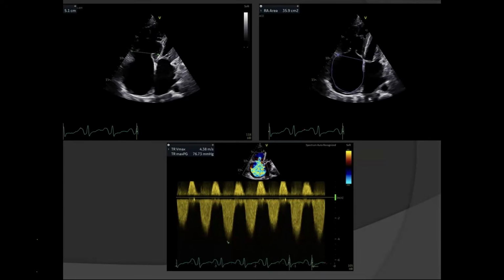If the patient has atrial fibrillation, we should have an average of 5 values. But in this patient, you can see the ECG tracing. The patient is in sinus rhythm, and this is primarily respiratory variation. So we've calculated the maximum pressure that we are getting, and there is nothing to average because of this reason. Is it inspiration or expiration? So that is a question for the audience, I think.